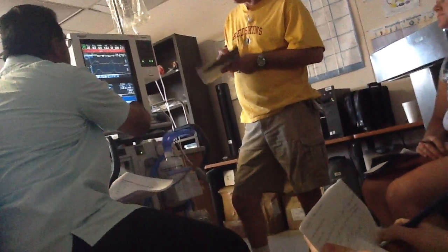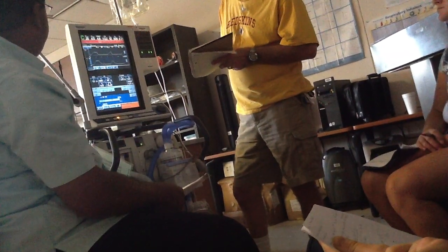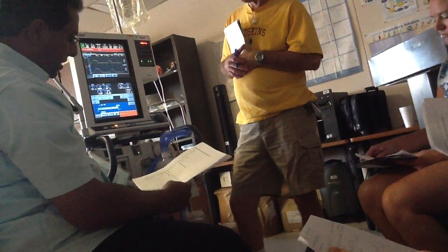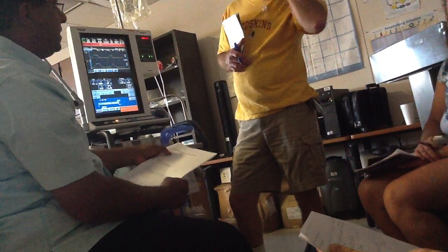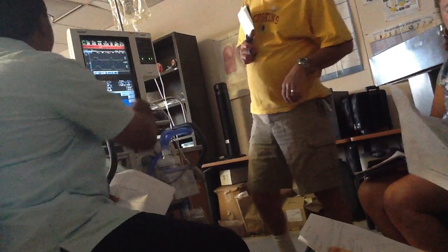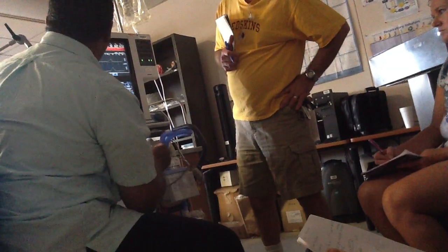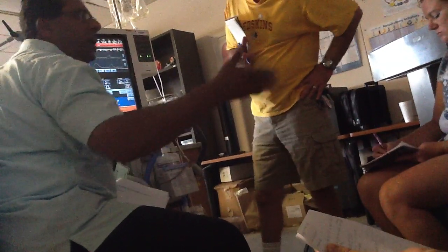Continue. It tells you what to do. The first thing they ask you when you push continue is, what rate? Did we change any rate? 12. I think we went up to 14 at one point, didn't we? No, what we are doing is the pressure control settings. So we are still on 12. So the rate's still on 12. And your PI should be what?